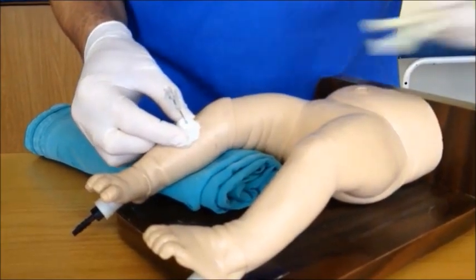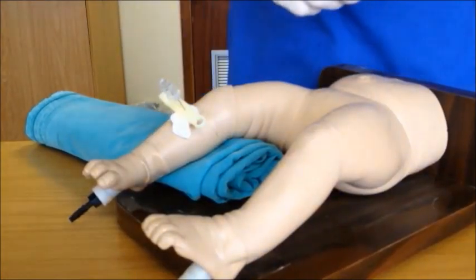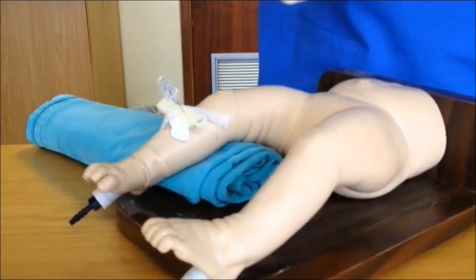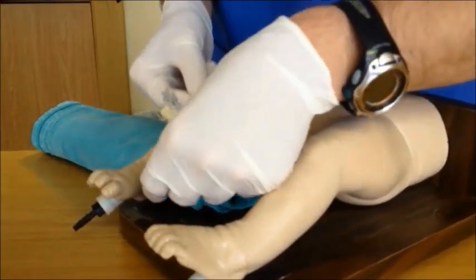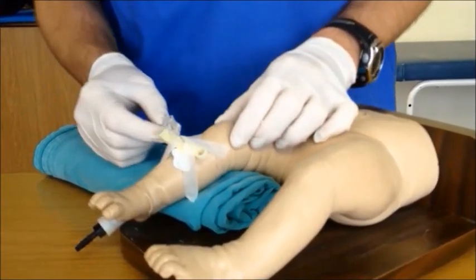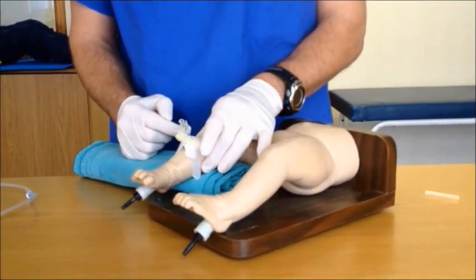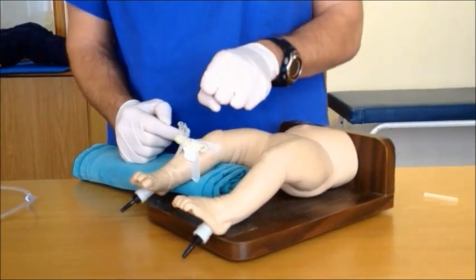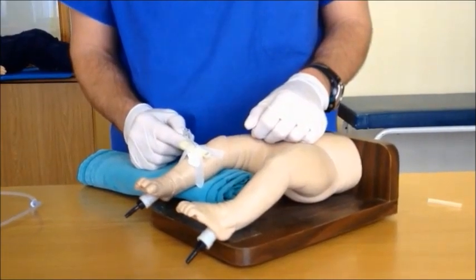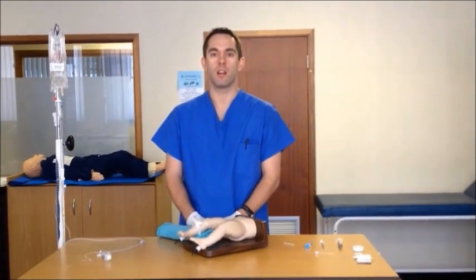You can then take an umbilical clamp, press it down and click it in place. The final step is to use some tape to secure it to the patient. Do not use a lot of circumferential tape to secure the needle — it obscures the leg for visual inspection and the regular palpation of the calf compartment needed to prevent extravasation. A constrictive circumferential bandage would increase vascular compartment pressures in the case of extravasation, increasing the risk of compartment syndrome. And that's it — correct insertion of an intraosseous line in a child.